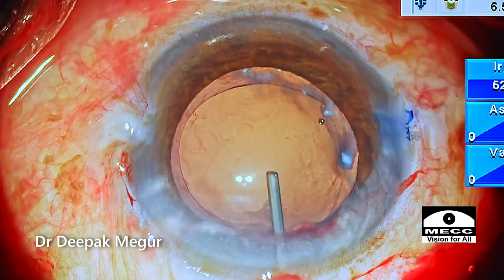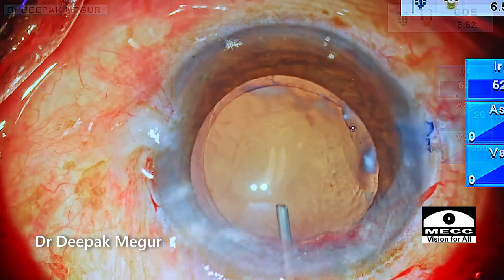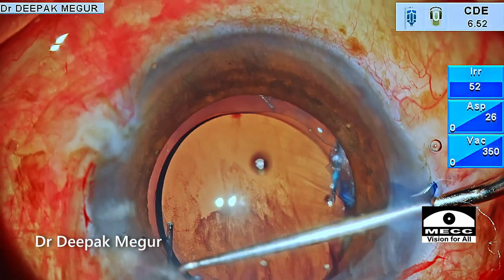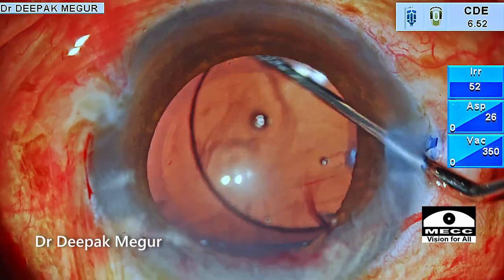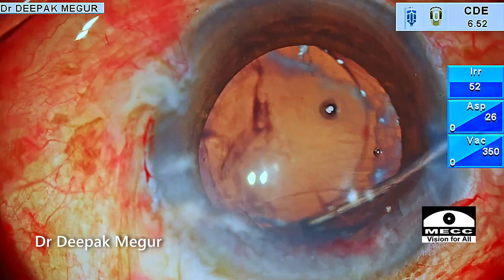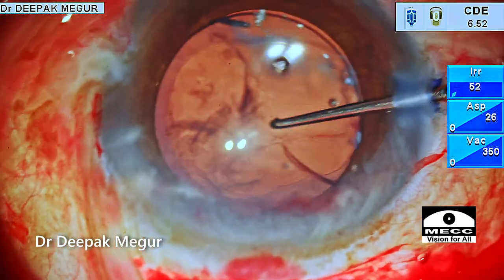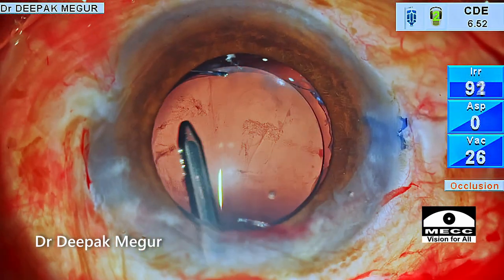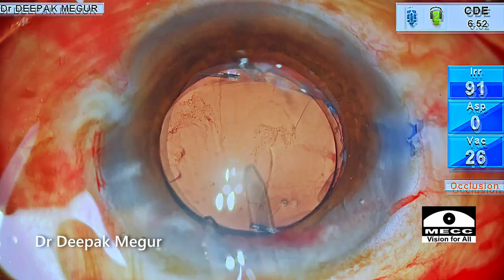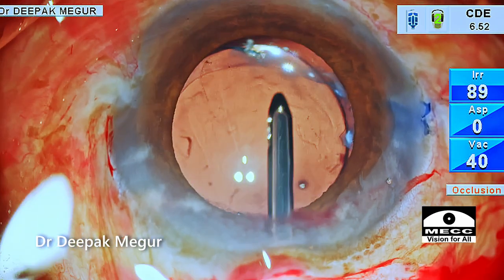The bag is now being filled with sodium hyaluronate to create space inside the bag, and then I'm implanting the multi-piece lens into the bag. Whenever we have a zonular dehiscence, there is a higher risk of fluid percolating across it and accumulating in the Berger's space, causing positive pressure — something like a misdirection syndrome. This is one of the most common reasons for positive pressure in eyes with compromised zonules, so having a good viscoelastic helps here.